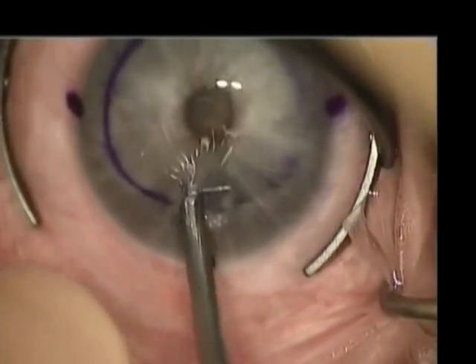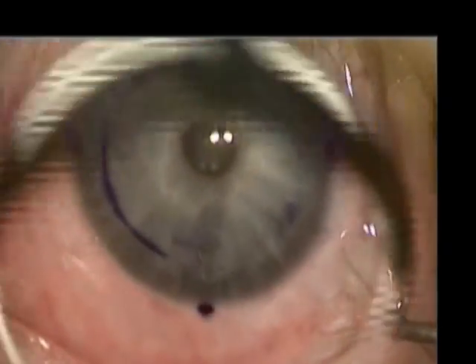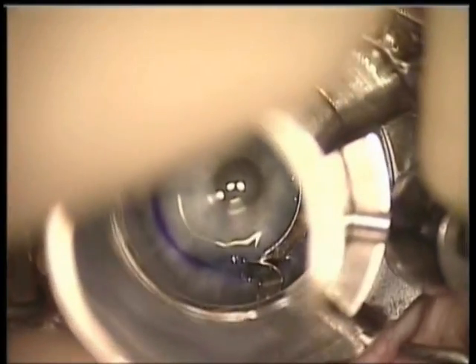Dissection is initially carried out with a Sinskey hook, and then the lamellar dissection is continued with increasingly larger pocketing hooks. The largest pocketing hook is then inserted into the incision and the channel dissector is then inserted underneath it and rotated to create the inferior Intacs channel. The same process is then done to create the superior channel.